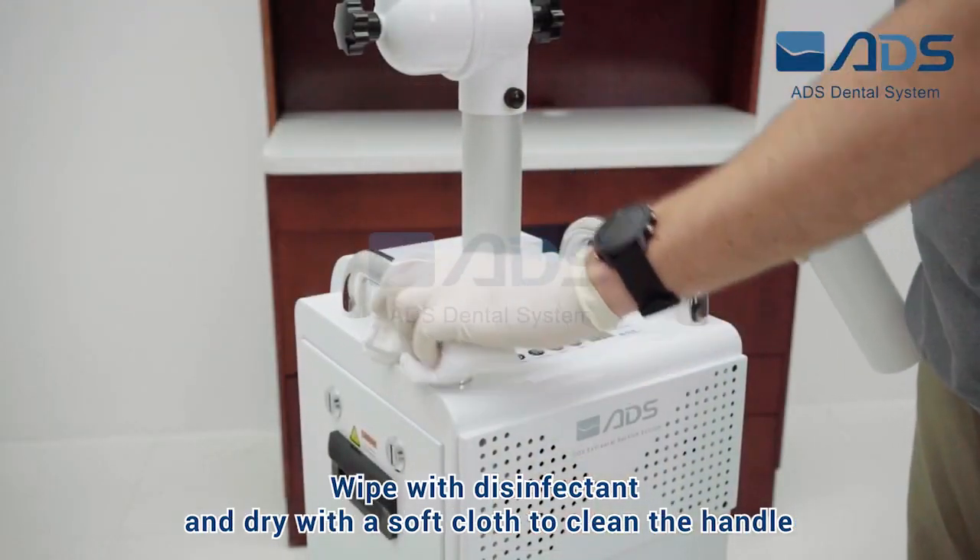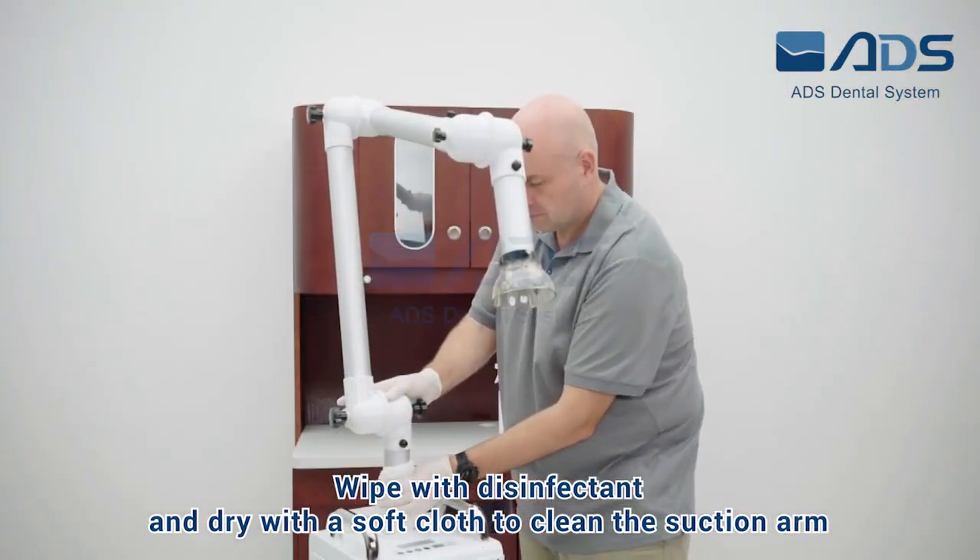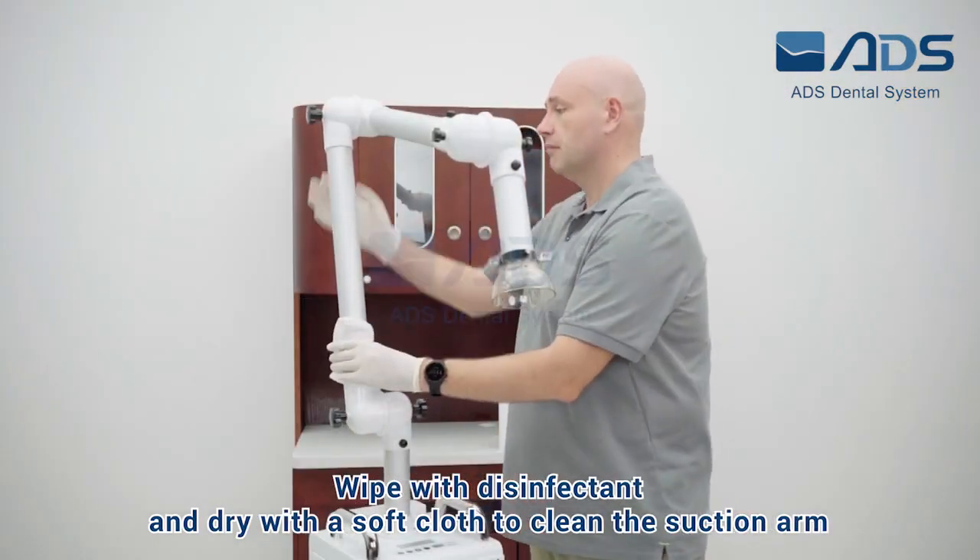Wipe with disinfectant and dry with a soft cloth to clean the handle. Wipe with disinfectant and dry with a soft cloth to clean the suction arm.